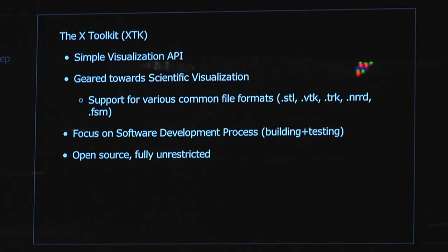So in our world we have a bunch of file formats like STL, VTK, which are popular to exchange medical imaging data. We made it so that they are supported out of the box in WebGL. So the idea was, if researchers want to visualize something on the web, they just put their files, which they have already, on the web, and write only little code to have a rich interactive 3D visualization using WebGL.